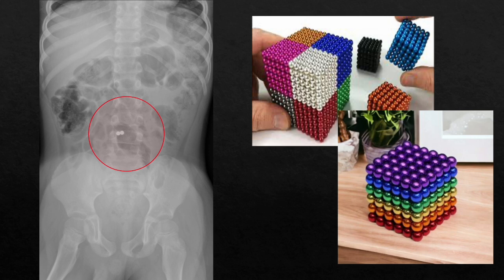So this patient then had an overnight stay and had some monitoring of these magnets. And over the next 3 months, they are still there. So we're still in progress, and I don't know if this patient's probably going to need surgery to have them removed, because they've not moved anywhere. So that's still ongoing. Please don't ever buy these toys, they're the worst.